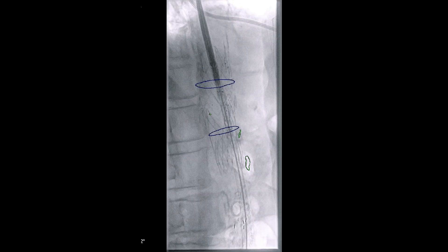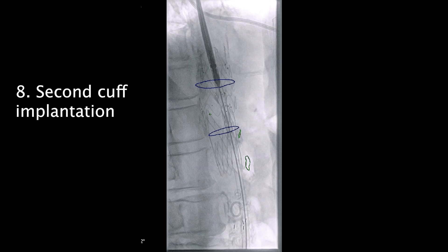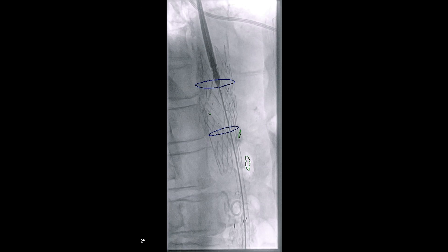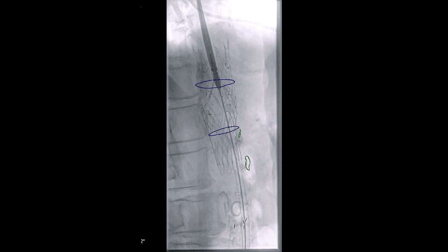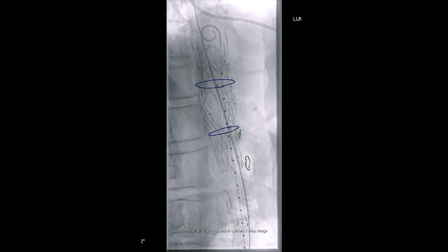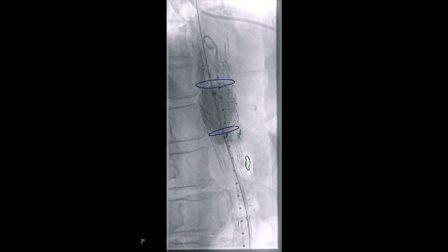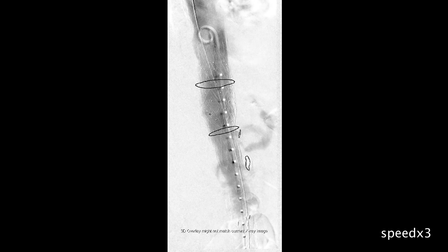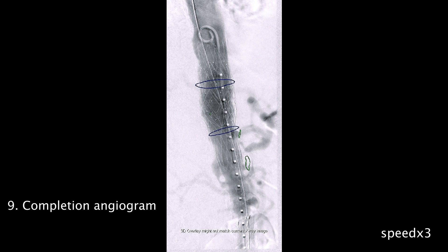A second 36 by 40 mm aortic cuff was brought to the operating field and deployed in a way that it was overlapping with the previous cuff on the proximal end while appreciating the marked celiac artery. Completion aortogram was no longer able to appreciate the lesion, deeming the procedure successful.